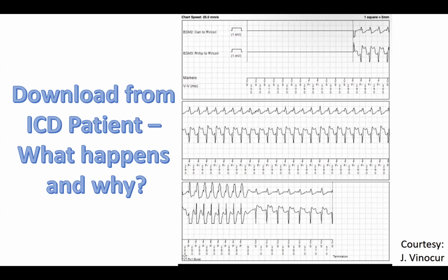Of course, the defibrillator companies didn't really like this, because the policies at that time were that if their device failed, they would give you the new device with the higher energy for the same cost as the device you had just put in. So you'd basically get two defibrillators for the price of one. Eventually, all defibrillators, or most defibrillators, were manufactured at high energy. And today, all the devices we put in have this higher energy. And so we don't see failure that often.